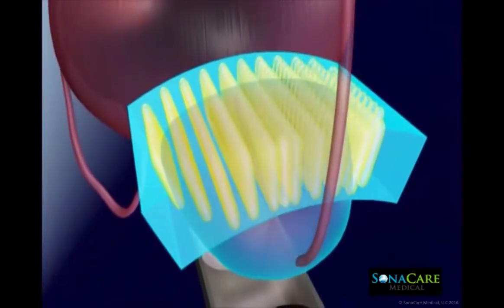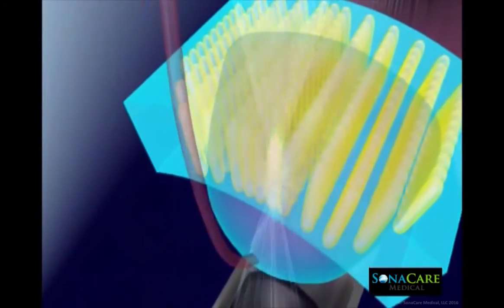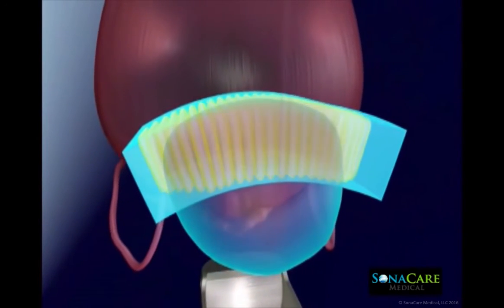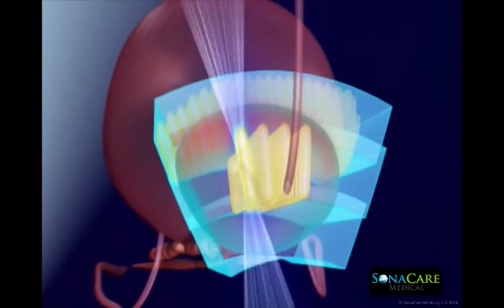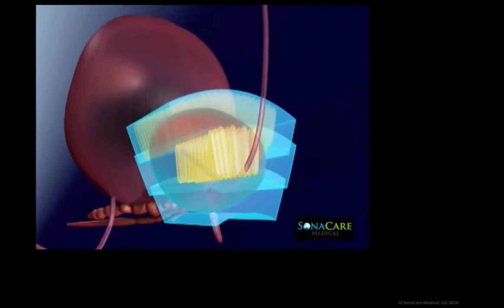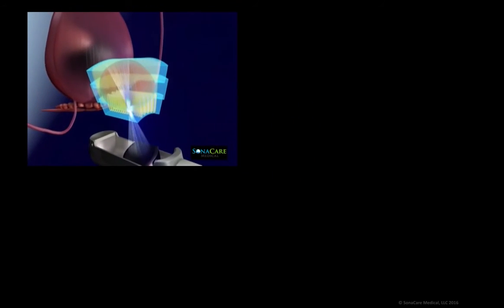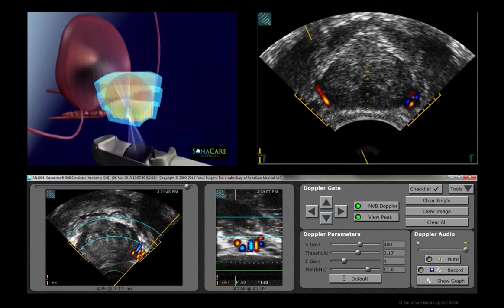HIFU is non-surgical and radiation free, with each yellow lesion being comparable in size to a grain of rice. The on-screen simulation represents a whole gland ablation. Amongst many product features, the Sonablate system offers an integrated Doppler feature that assists in the identification of structures that affect sexual function.